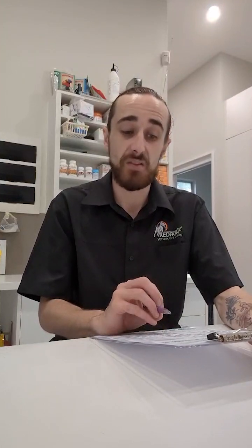If we had any shading, say on the buccal side of the teeth, for instance, then we would gently shade the back of the tooth here on the dental chart just to show where it will be stained. And if we had any periodontal pocketing above 2 millimeters, that would need to be noted and will be written as the number of millimeters next to the indicated tooth.